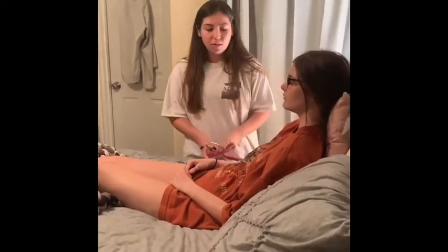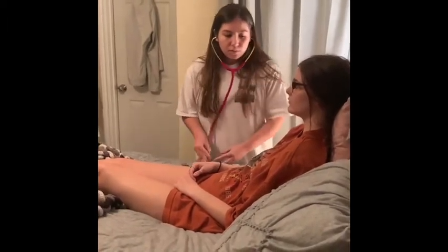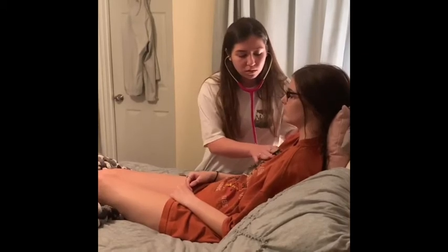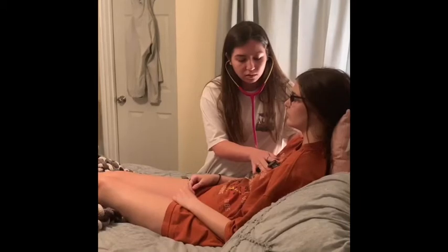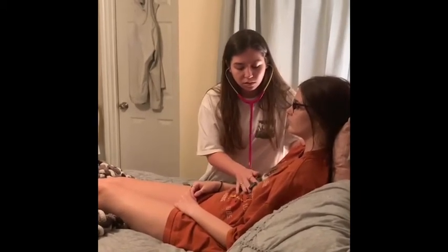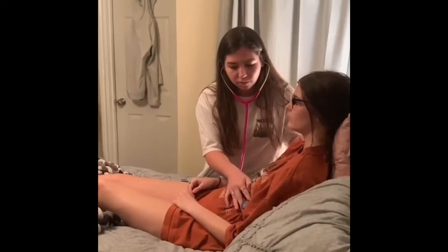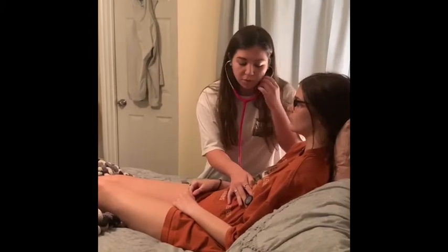So now I'm going to go ahead and listen to the different parts of her heart. So here we have the aortic. Her pulmonic. Tricuspid, and her mitral.